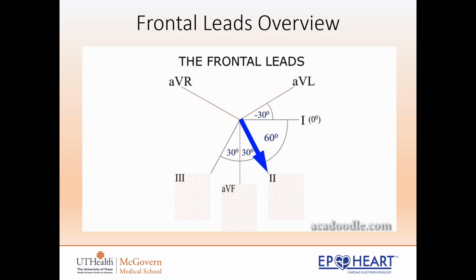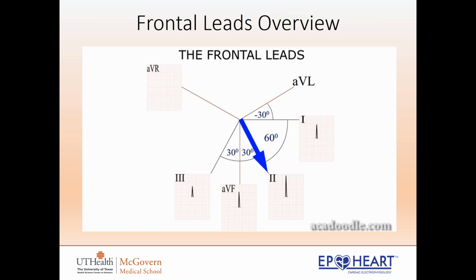So the QRS complexes are expected to be strongly positive in these leads, with dominant R waves. It is also well within 90 degrees of lead 1, so this lead also tends to have a strongly positive QRS complex. Note, however, it is traveling almost directly away from lead AVR, so it produces a negative deflection in this lead.